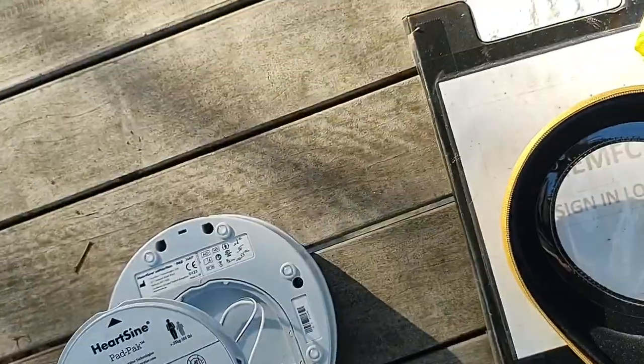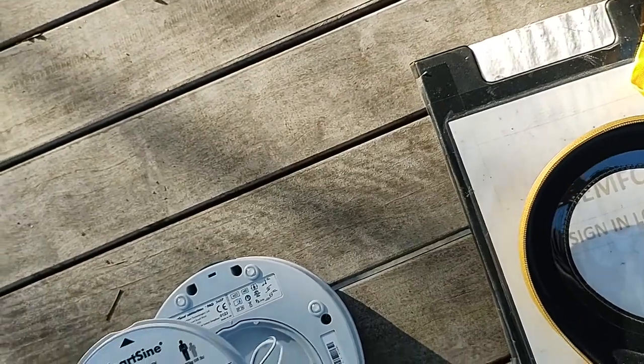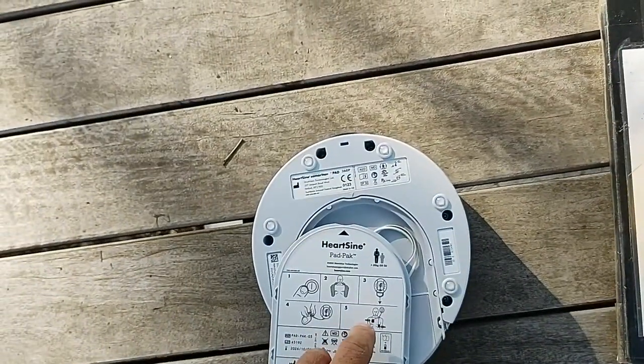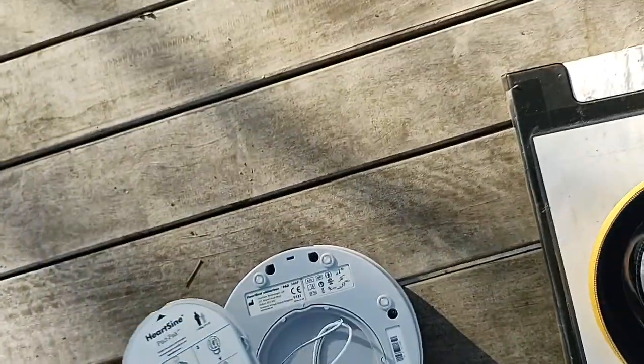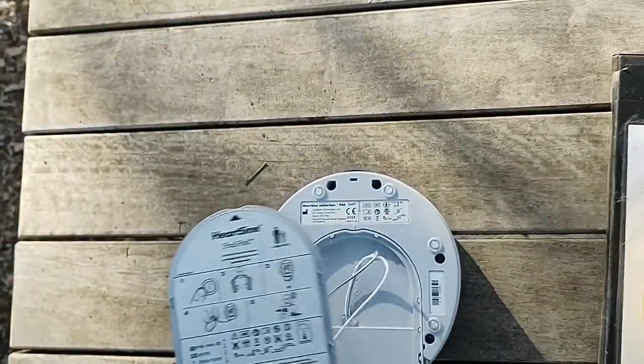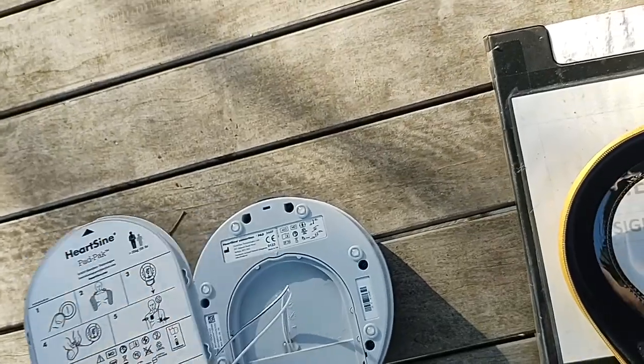We open up the back here, which is where the pads are. Extract those and place them on the chest of the person — one high on the left and one low on the right. From that point onwards, the machine will be telling us what to do automatically.